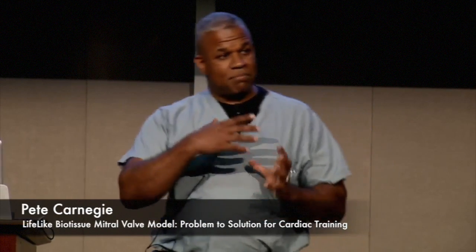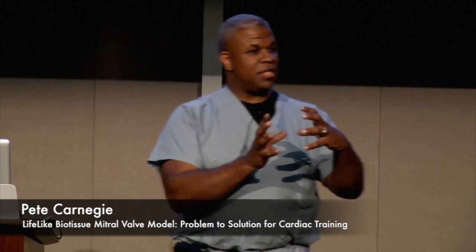So as a result of the heart being rotated, and not how we think it is but in real life it sits this way, we had to create the shape of the valve such that when the surgeon opens the left atrium, he or she is looking right at the valve in its normal state. And that would be what they're used to seeing. We had to replicate that.